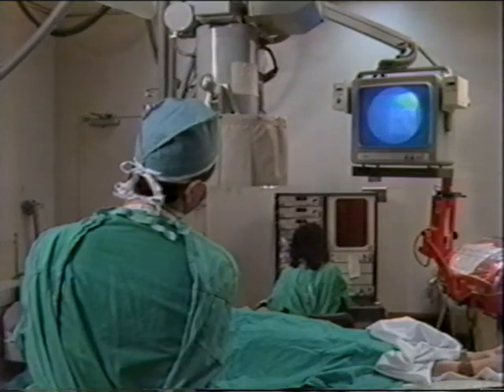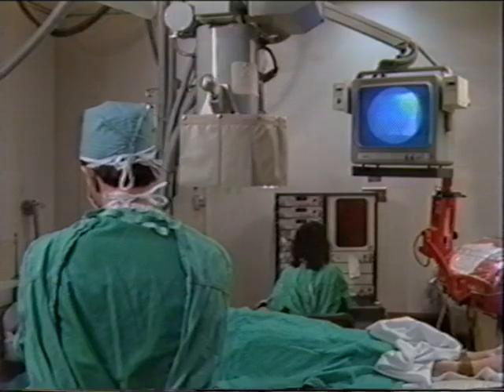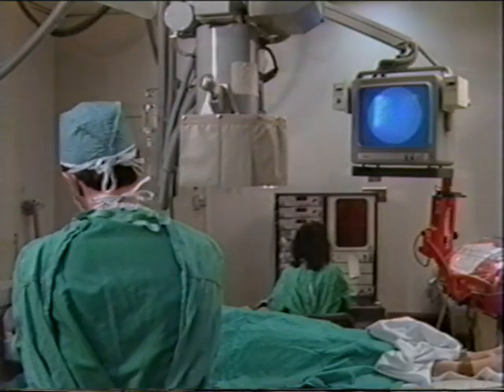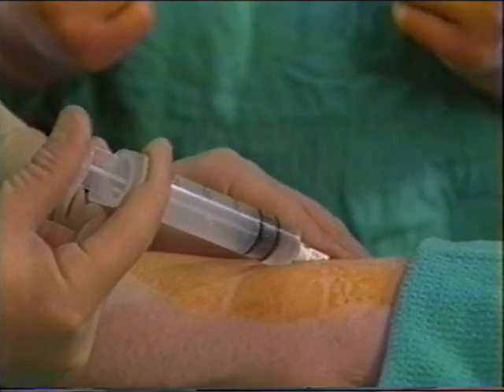Using a special X-ray machine called a fluoroscope, your cardiologist will watch the movement of the catheter as it is advanced through your blood vessels up to your heart. The catheter tip will then enter the heart itself. Once the catheter is in position, blood samples can be taken to be analyzed for their oxygen content. To film your heart structure, a dye-like substance will be injected through the catheter into your heart.